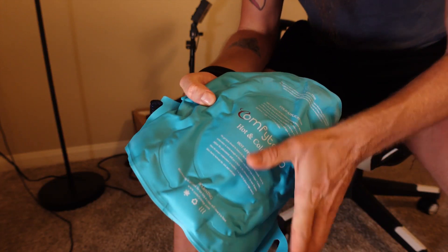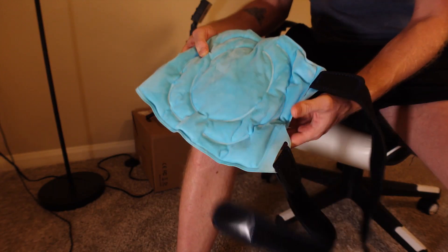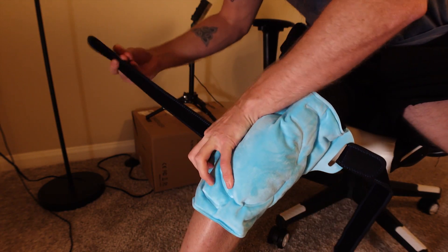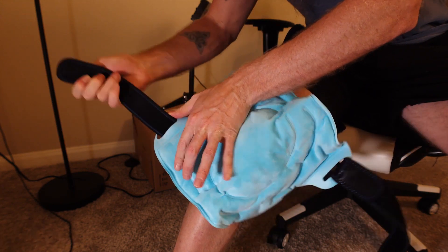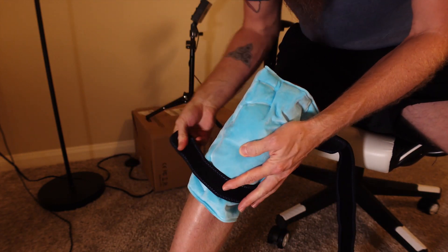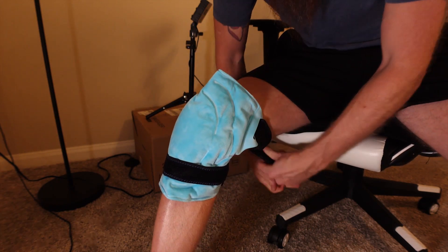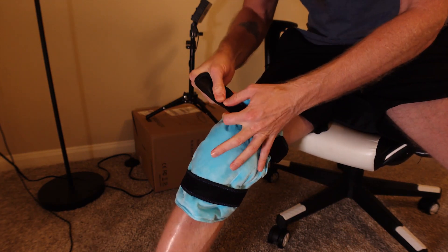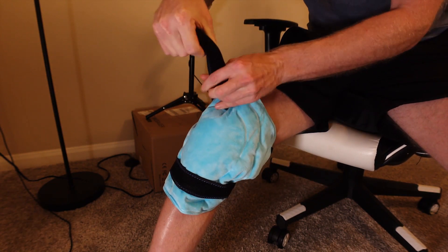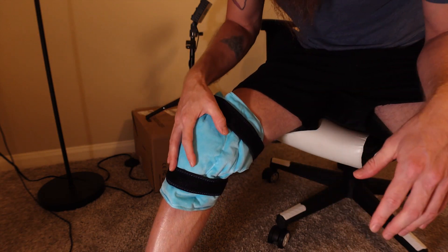I just put it in the freezer for an hour so it is nice and cold now. I'm going to put it on the silky side rather than the soft side like I did with the hot compress. One thing with these is they do fit on left or right leg so you can use them on either leg. I have the ice on there now — oh, this feels really good actually. Let's tighten this up. Now I've got it on and it feels really good on my knee.